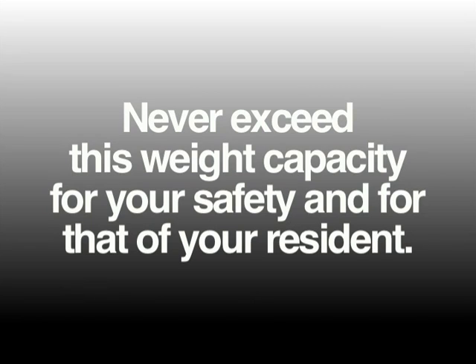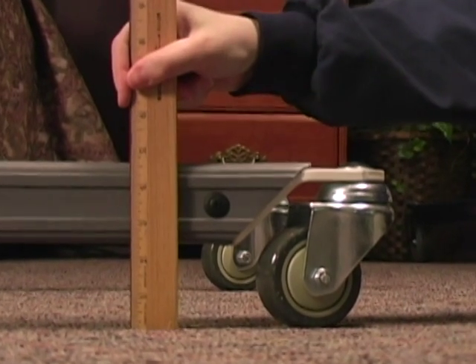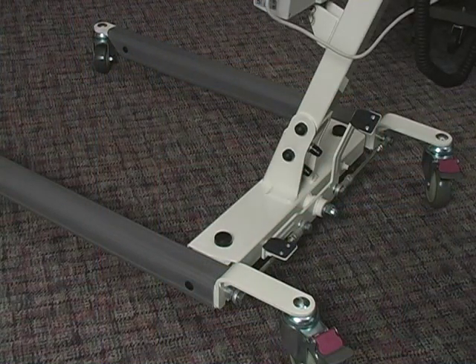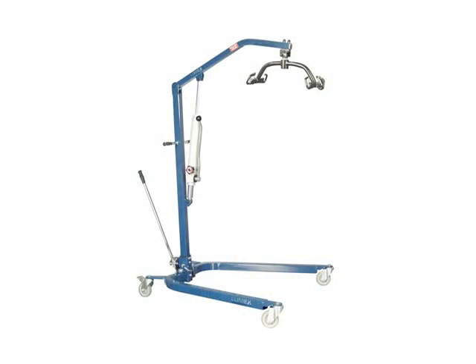You will notice that the base legs are very low to the ground — only 4½ inches above the finished floor for the LF-1050 and 5¾ inches for the LF-1090. The LF-1090 is also available at 4½ inches. This allows the lift to accommodate low beds. There is a very simple device for spreading the legs: simply press one lever to open and the other lever to close. The device is ergonomic and intuitive to use.